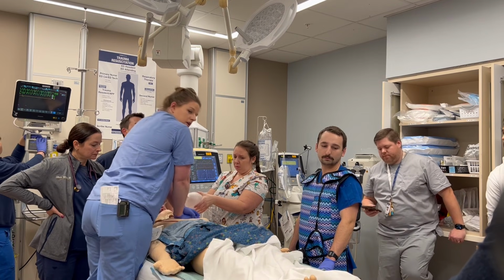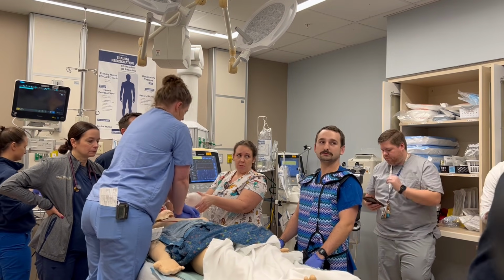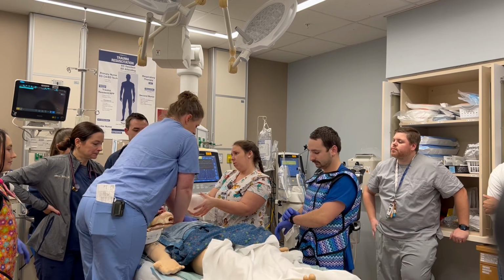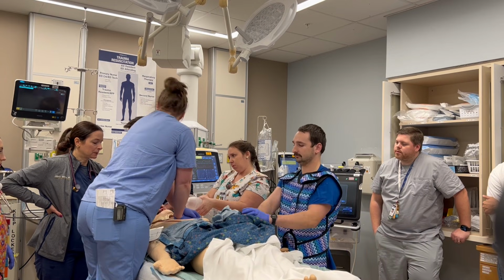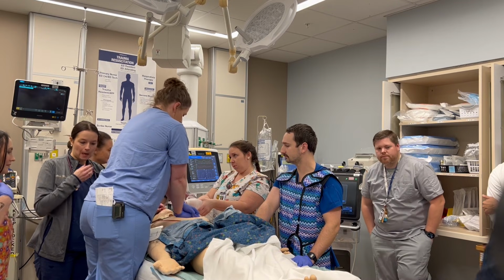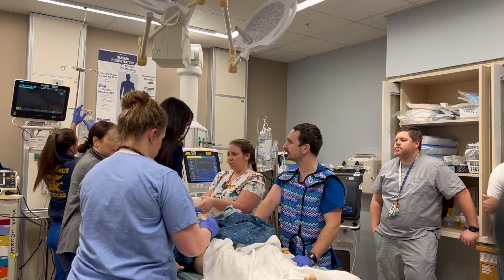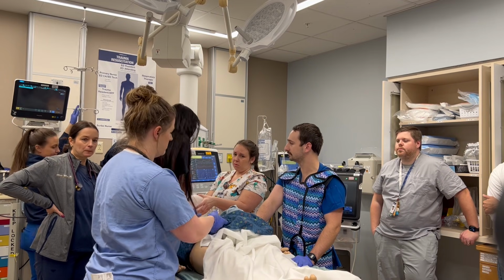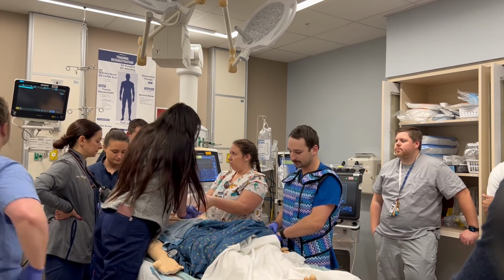Put the monitor over. You ready for a pulse check? We have 20 seconds. We'll do a pulse check and switch out whenever you need to. Ready? Yes. Pulse check. I still don't feel a pulse. Pulse check. No pulse. So PEA. Still PEA on the monitor.